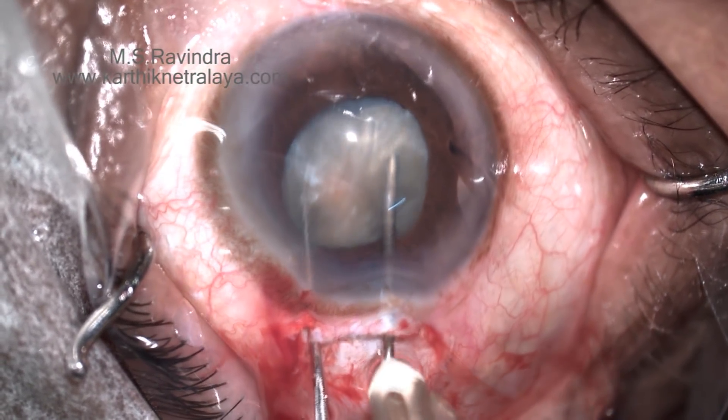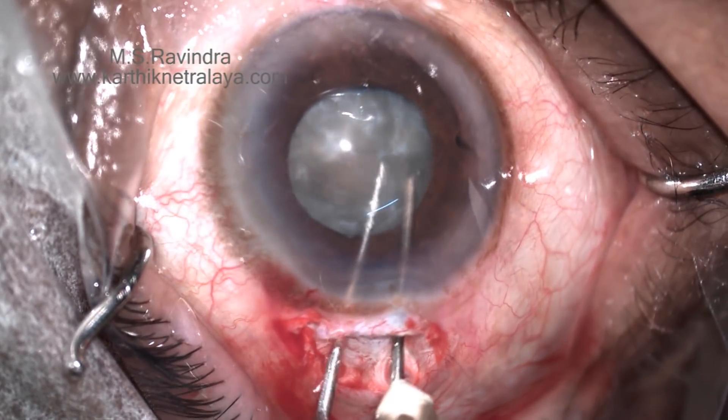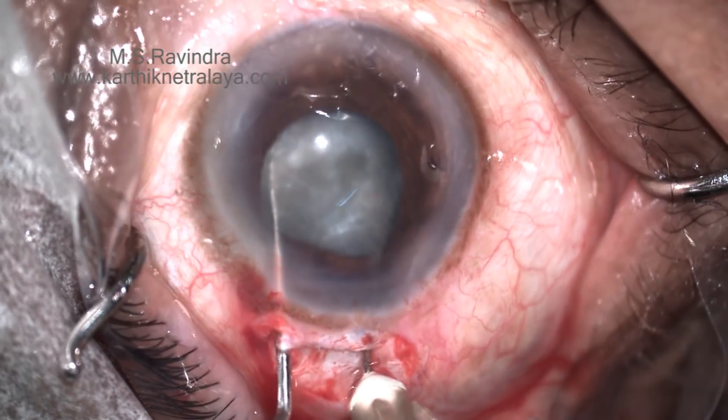The cataract nucleus and epinucleus are rotated within the capsular bag. In this case, hydrodissection is not done as we cannot see the posterior capsule.